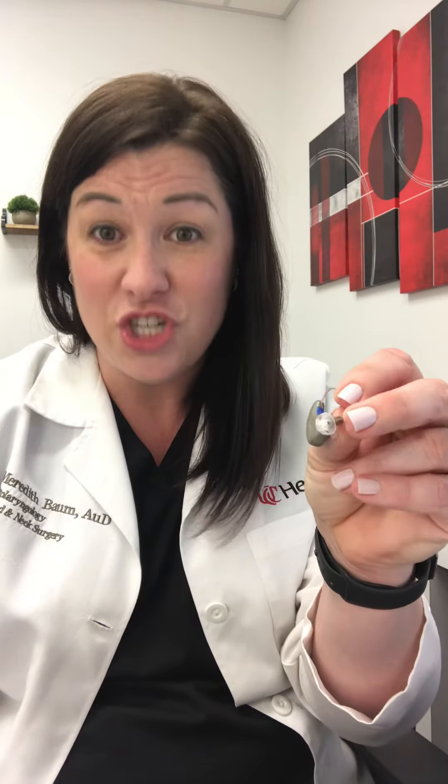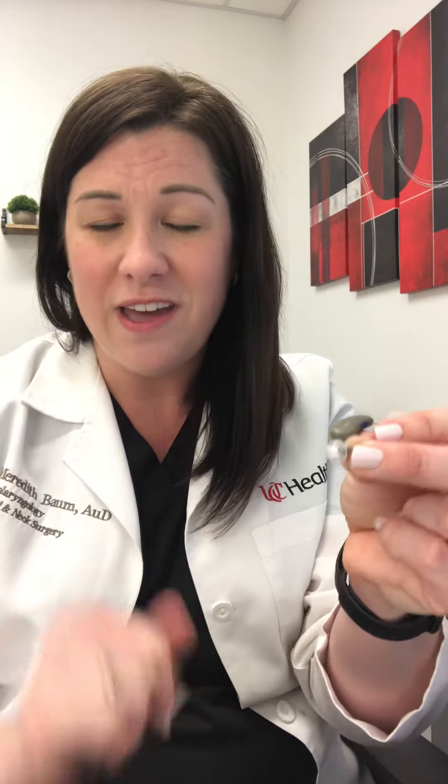Now, at some point, sometimes that wax gets so much in there that you can't hear anything from the hearing aid, so you want to go ahead and change it. Signia uses click domes, which are a little bit more difficult to get off than other hearing aid domes, but that's okay — we'll show you how to do it.